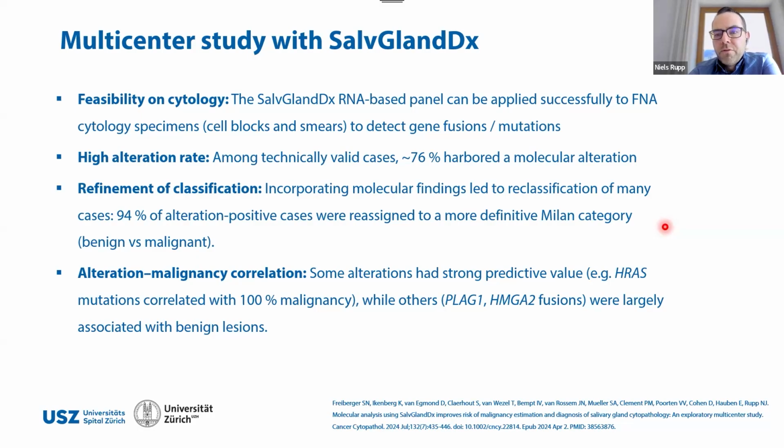We can either do it on cytology on cell blocks, but we can also do it on smears. And from our experience, it's much better to do it on smears, which are not formalin fixed, paraffin embedded.